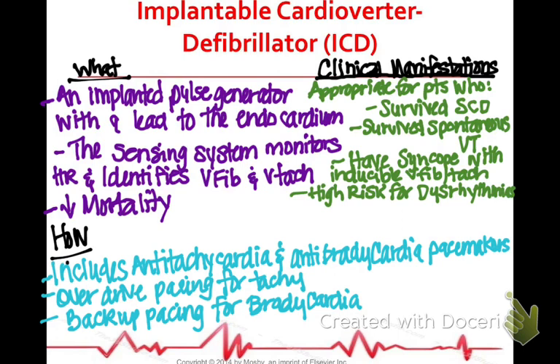So the ICD is just an implanted pulse generator for someone that has high risk for dysrhythmias, VTAC, VFib. So it will basically shock the heart if needed.